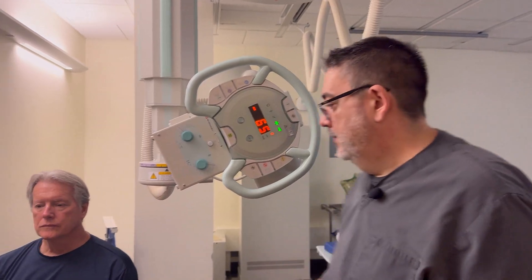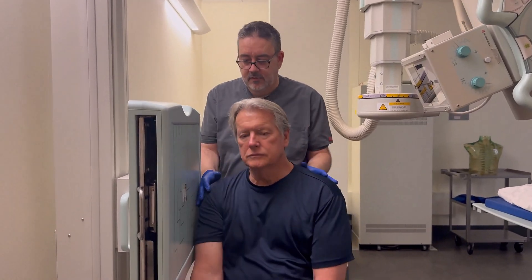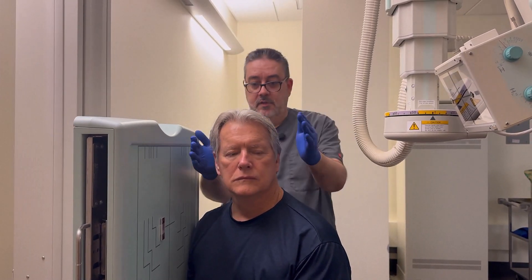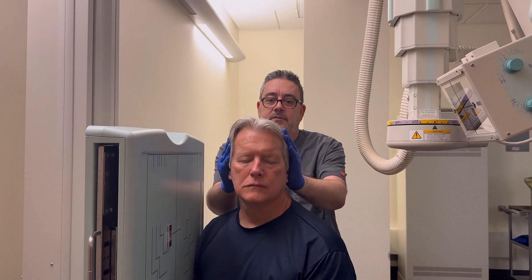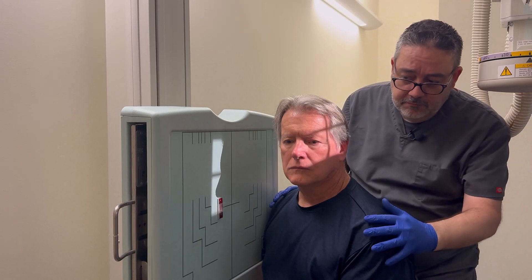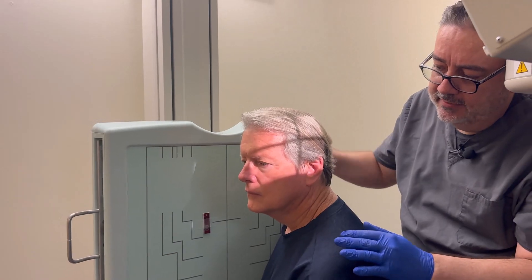We'll get the patient in a lateral position. We're going to turn your head to the left — a little more to the left. We've got a little tilt so I'm going to tilt to the left. I want to check for anterior angle here. I'm going to need to slide you forward a little bit. I'm about two and a half inches superior, so we're going to move you forward so that this crosshair is over the upside TMJ. But it'll be exiting the downside.